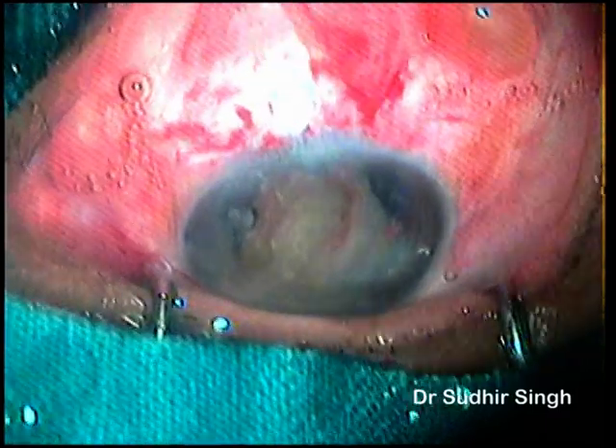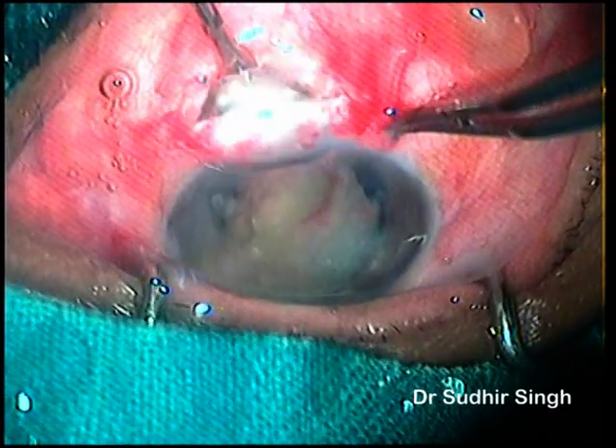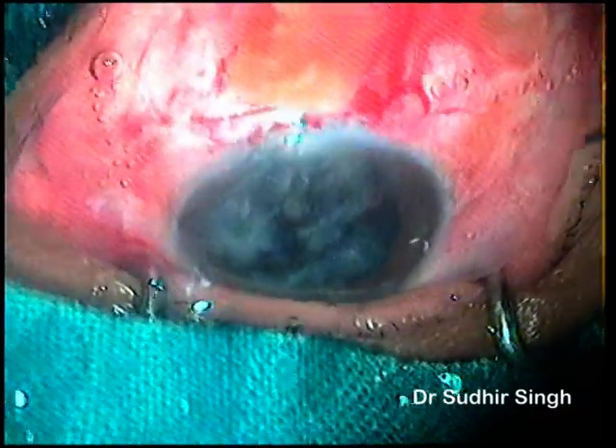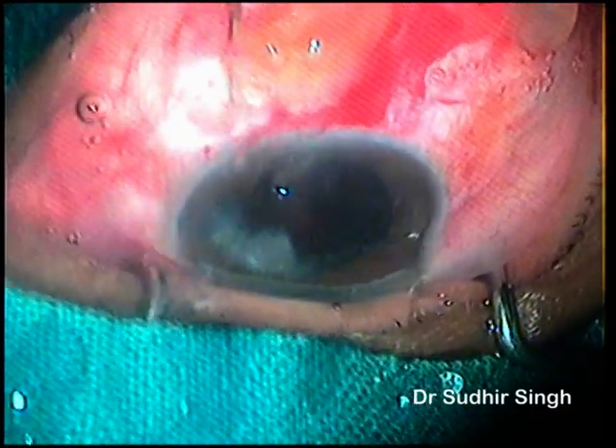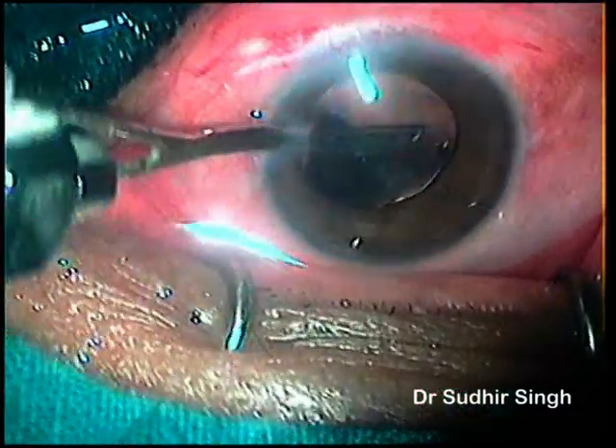The posterior nucleus fragment is taken out while the remaining fragment is pushed back into the anterior chamber. Viscoelastics are again placed around the nucleus fragment and it is taken out. Cortical matter is cleaned up and a 6 mm PMMA IOL is implanted.